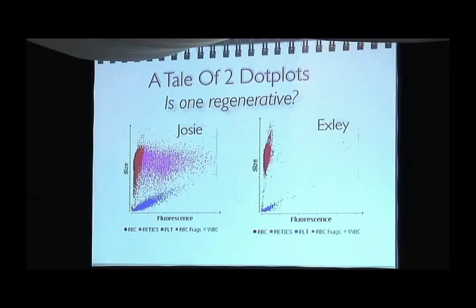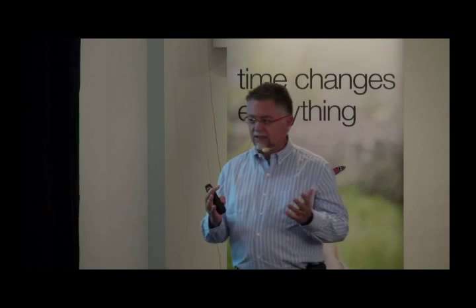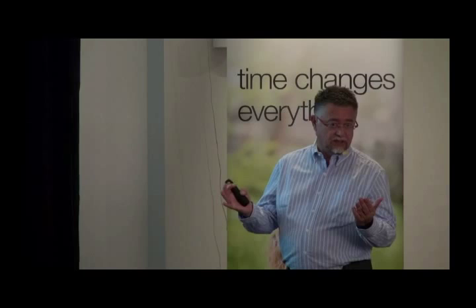All right, anybody counted dots? No. You looked at this and you went, I don't know what expression you use in Australia, holy mother of God or something like that. Look at all those purple dots, all right? So usually in the clinic, this is how they come to you. They either have a lot of purple dots or they don't have purple dots, right? Simple, okay? There are very, very few that will be in the middle.